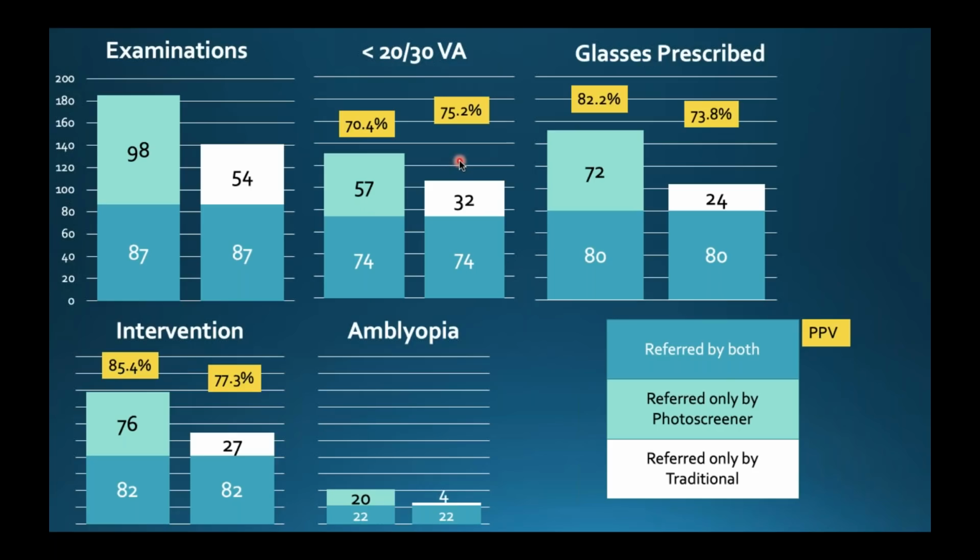I have several ophthalmologist friends who actually utilized this technique and did not get their nearsighted glasses until they were in middle school, when they would have benefited from them in 4th or 5th grade, because they were excellent students and could memorize things very well, and spit back out the answer that their peer gave when it was their time for their screening. One of the fears that I had is what is missed by either one of these groups if you are just doing photo screening or just doing traditional based screening.